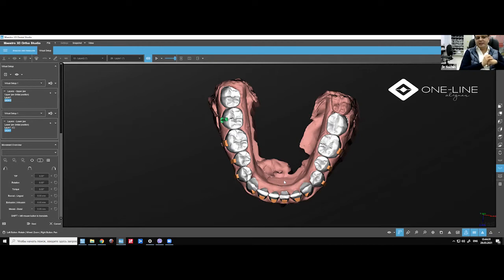So if somebody is using different kinds of sheets, I do understand the idea, but we just use one kind. Nicholas from Vietnam is also using just one kind, 0.5, which I believe is too thin. We use 0.75. The effective thickness from 0.75 CA Pro Plus comes to 0.7, 0.68 after the thermoforming.